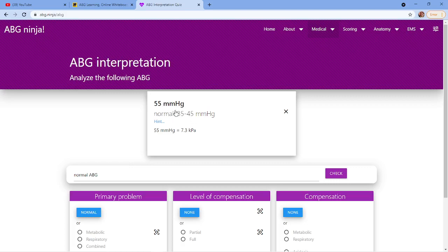So why do we have a high CO2? We don't know, but that's pretty high. I would wager a guess this is a COPDer, probably, but we don't know that for sure. But that's a high CO2 level. So we definitely got some acidosis going on here from the lungs. The lungs are not helping us out, but thankfully our pH is normal. So we're compensating really well.